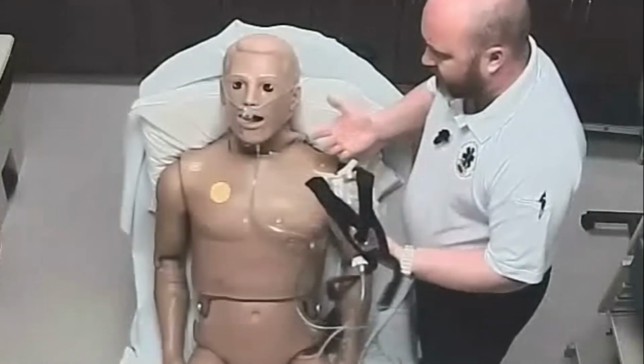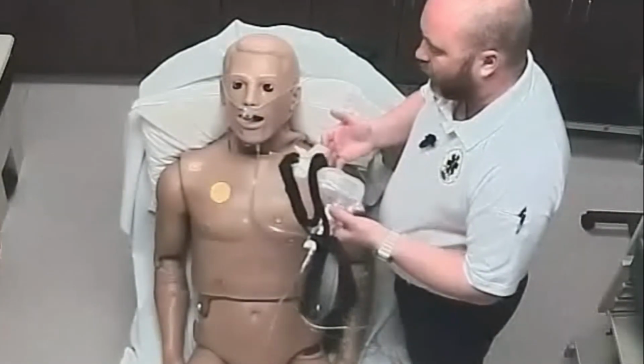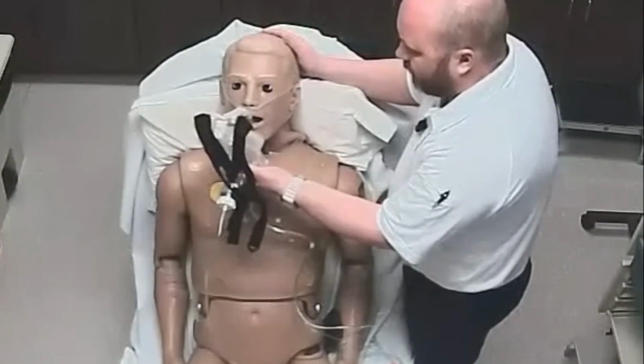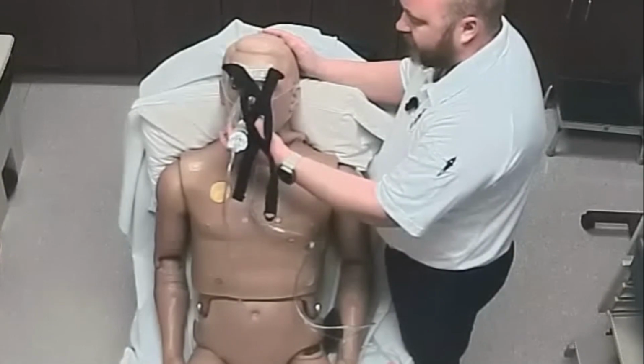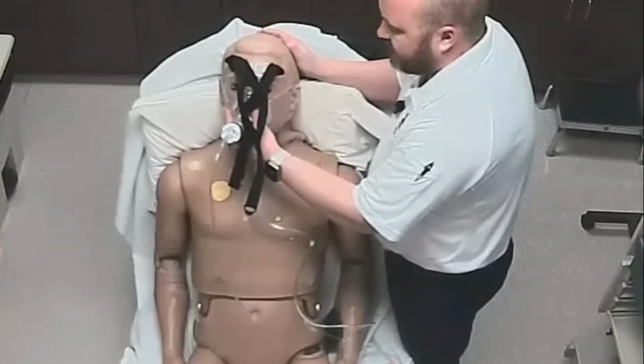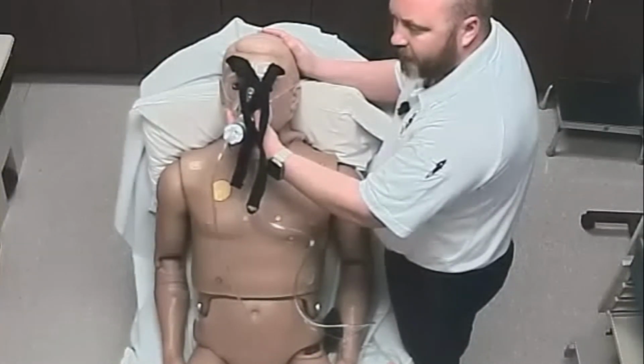We're going to coach the patient. You can either have the patient take the mask and apply it to themselves, or you can coach the patient and slowly ease it towards the patient's face. Once the patient becomes more and more comfortable, you can get closer and closer to the point that you actually formulate a seal. Once we have a seal, we're going to wait here for a minute or two until the patient is comfortable with the mask.